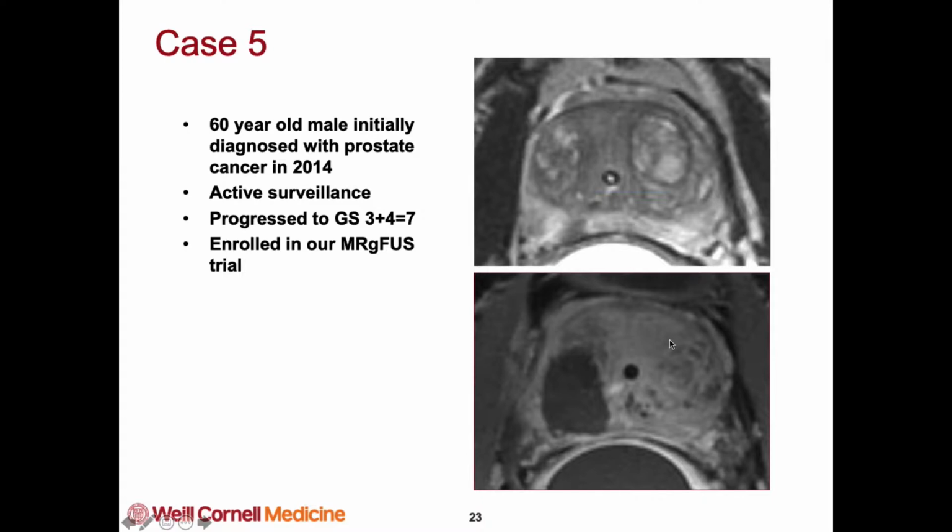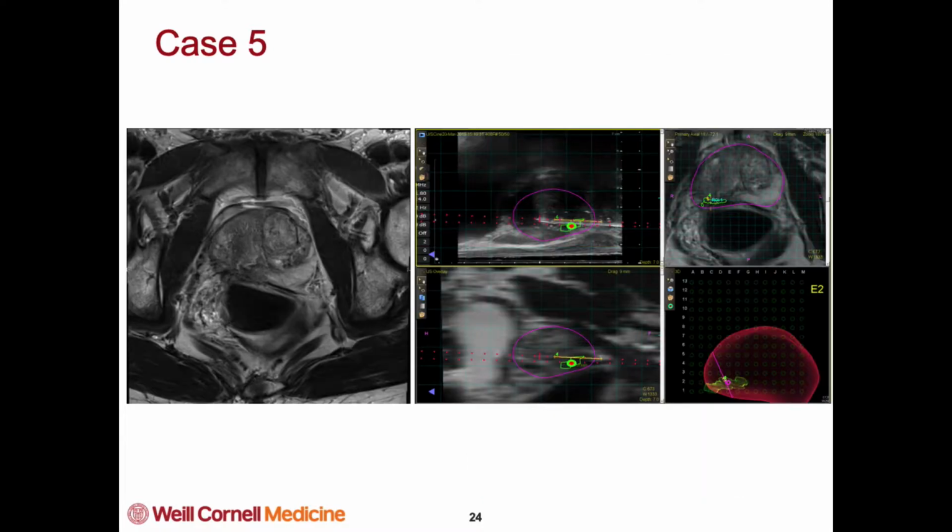And this basically here is an axial image of the transrectal probe and ablation device, and this is a post-ablation contrast-enhanced scan. It's showing the area of no perfusion after we did the procedure, which was good. He was really worried about both urinary and sexual health, and at 2 years he had the same urinary and sexual health he had. We did a 2-year biopsy.